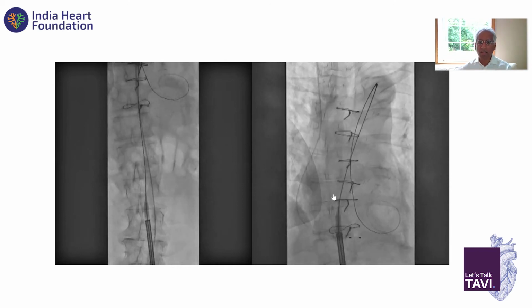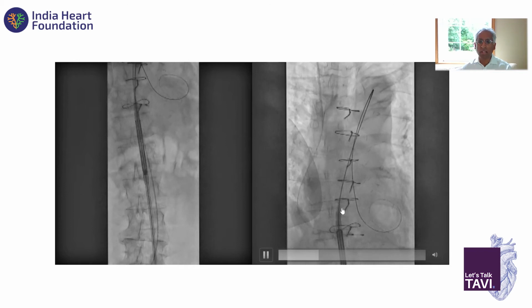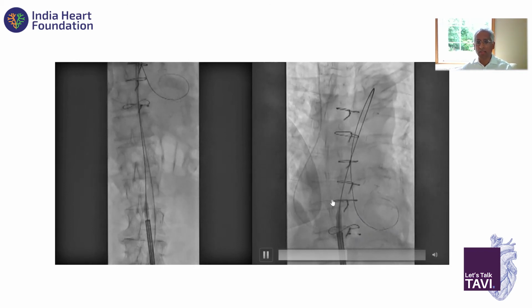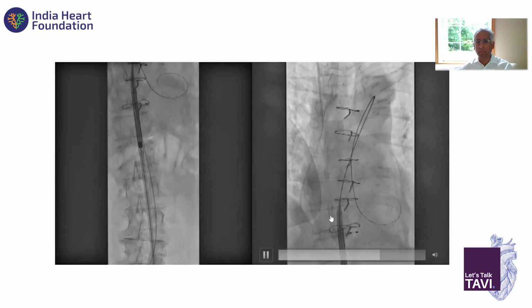And then it gets stuck in the thoracic aorta. Again, on the CT, I didn't show it, there was an area of calcification just invaginating into the aortic lumen. Try different techniques, come back usually.